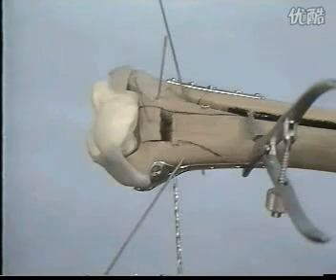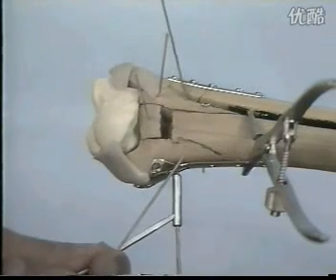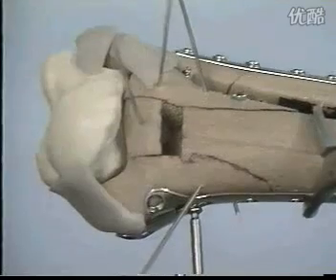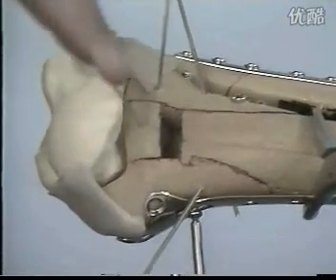In the distal area, we use cancellous bone screws through the plate as well as to replace the Kirschner wires. Through the fixation of the plate, we simultaneously jam the previously impacted central fragment in its place.